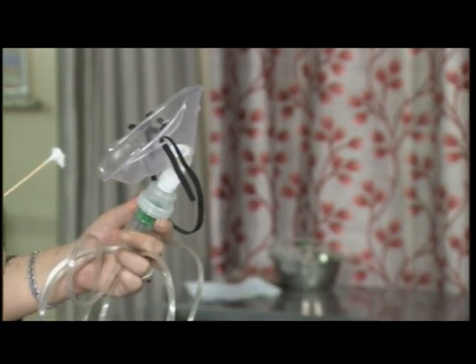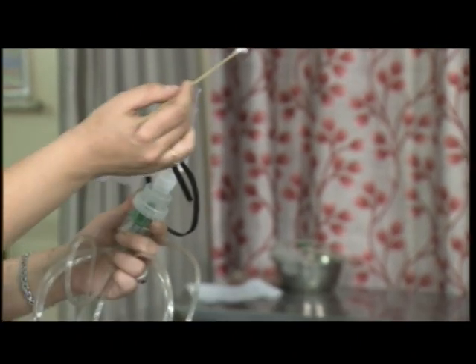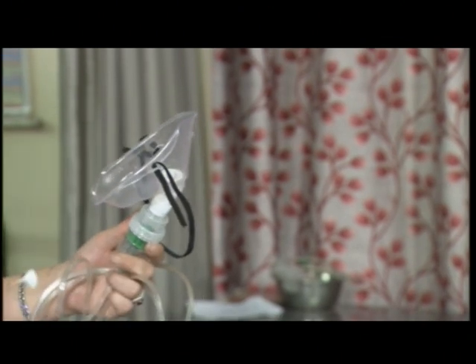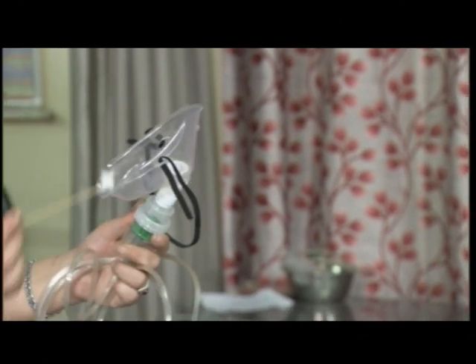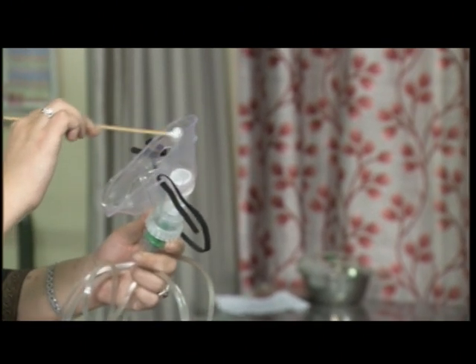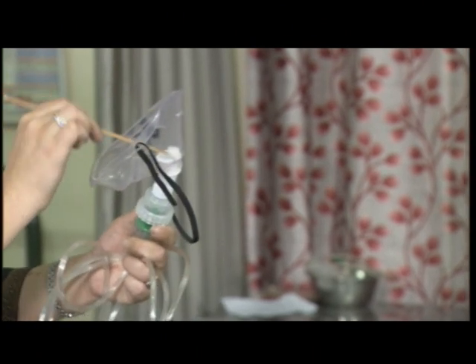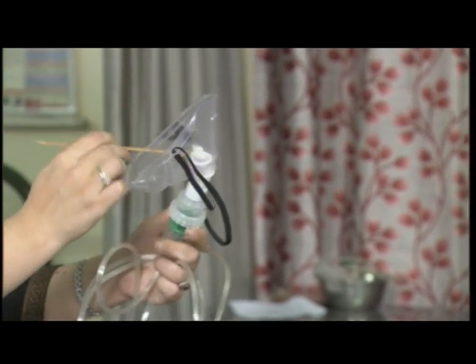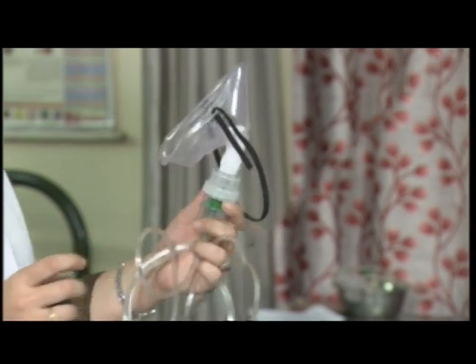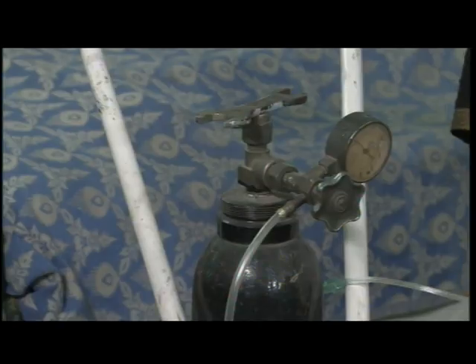With the help of swab sticks, we will clean the nostril of the patient, and if required, we can also clean the face mask or dry it out. Now we have cleaned our face mask.